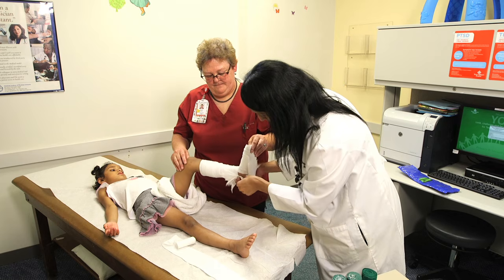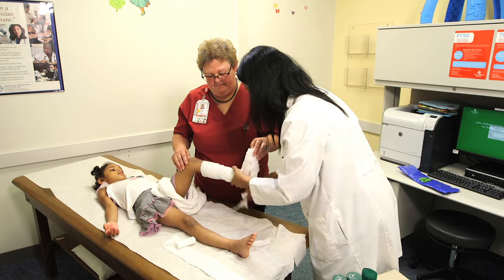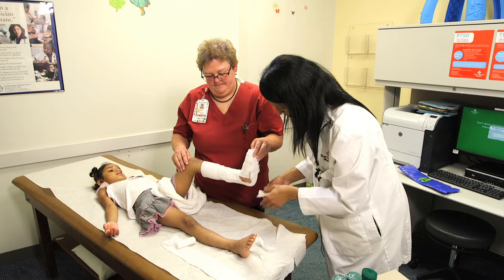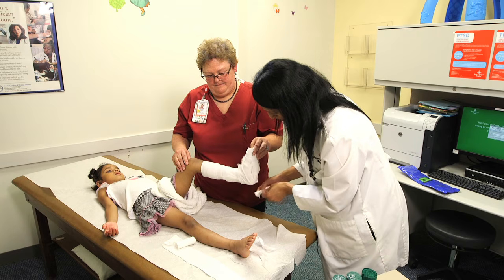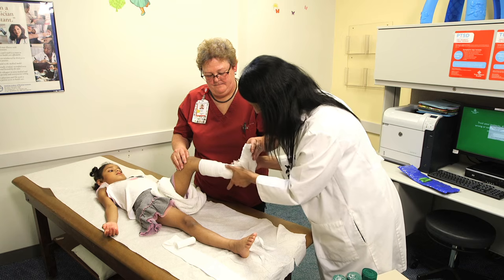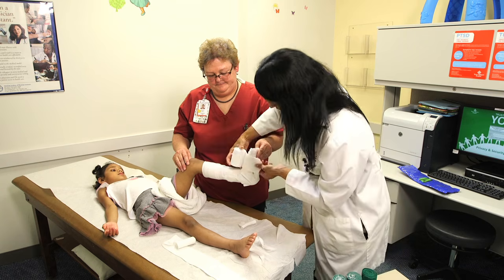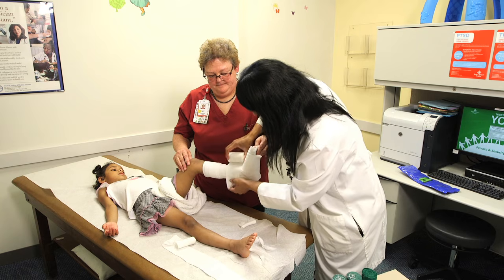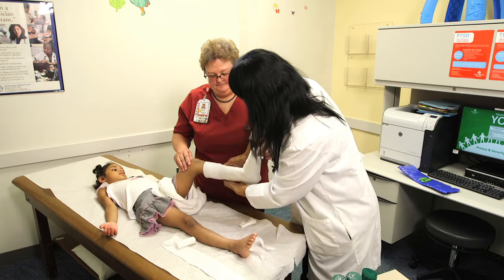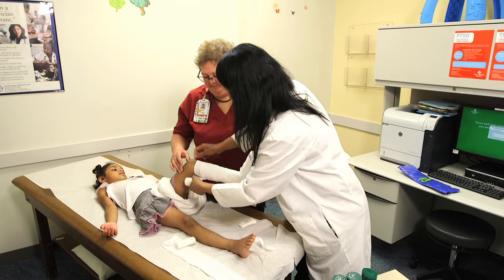If it's very redundant, you can then tear it so that you don't develop a lot of wrinkles. And again, you want to cover the skin entirely. You want to end with kind of a nice, clean, smooth finish. And then you're going to take it all the way up the leg.